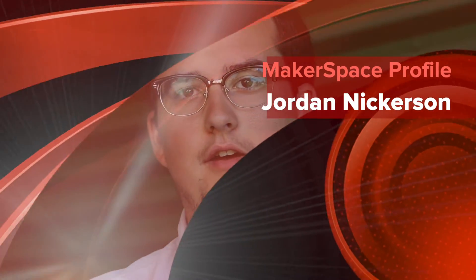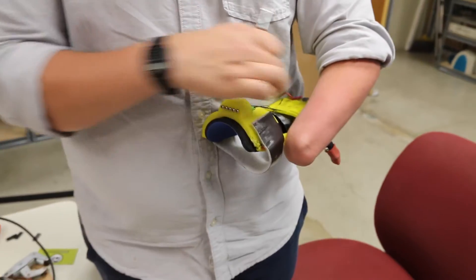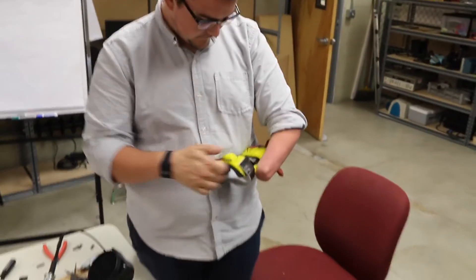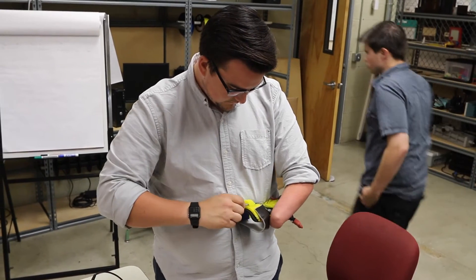I've always had a fascination with prosthetics, for obvious reasons since I don't have a hand. I never really dove into it until back in April, when I met this guy named Sashi at a networking event. He was talking about this hand he wanted to print out and had a rendering on his phone. I got intrigued, walked up to him, asked about it, and that's essentially how it all started. We met up a couple of times and printed out this prototype here.